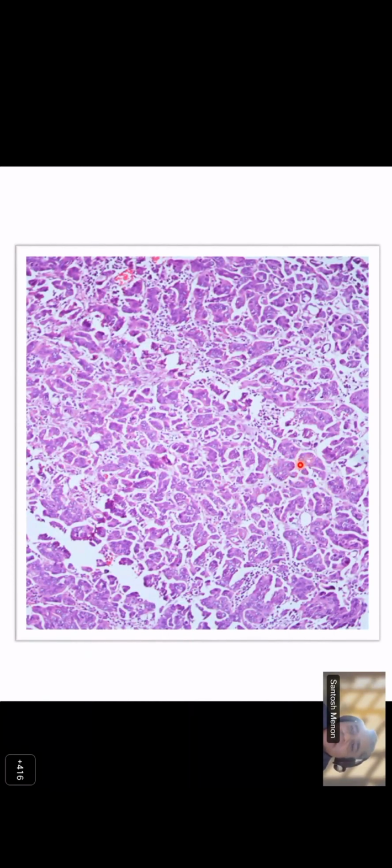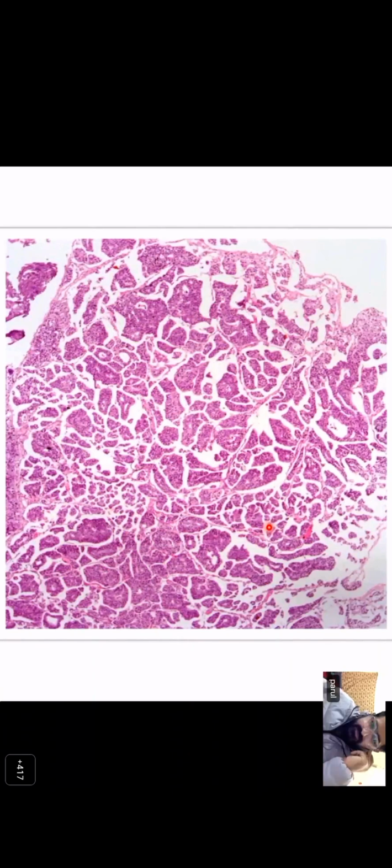There is some lumina in between. Yes, sir, they appear to be present within large lacunar spaces, multiple bits of whatever you want to call it, malignant urothelium or whatever it is, within this. And then there are lymphocytes all around this here, which you can see. This is from a different case, but had similar morphology. Again, you have these floating kind of micropapillae.